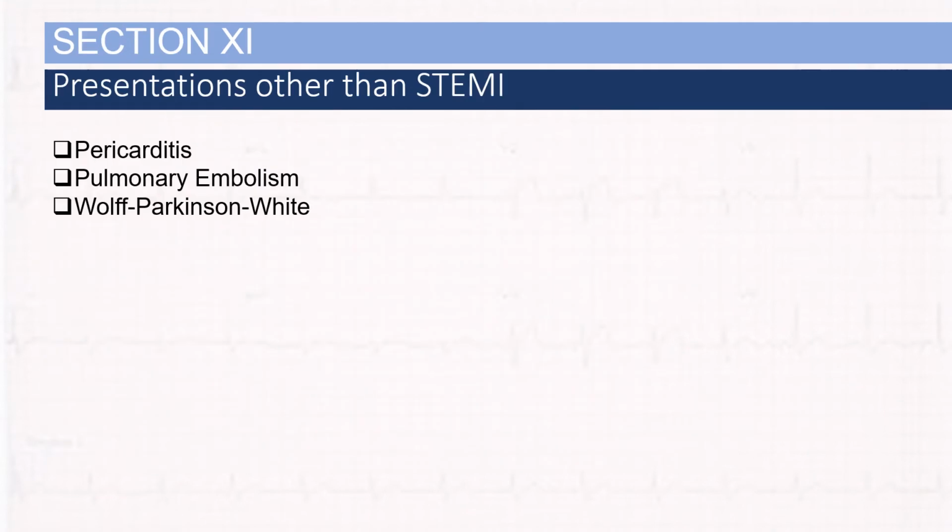You are called to the residence of a 60-year-old male. He complains of chest pain, which is atraumatic. 8 out of 10, it's sharp, radiates to his jaw. It worsens when he lays down and improves when he sits up. He doesn't have any shortness of breath, nausea, dizziness, or weakness. He states that he smokes 1 pack a day, doesn't consume drugs, and he consumes alcohol from time to time socially. Nothing in the recent past.